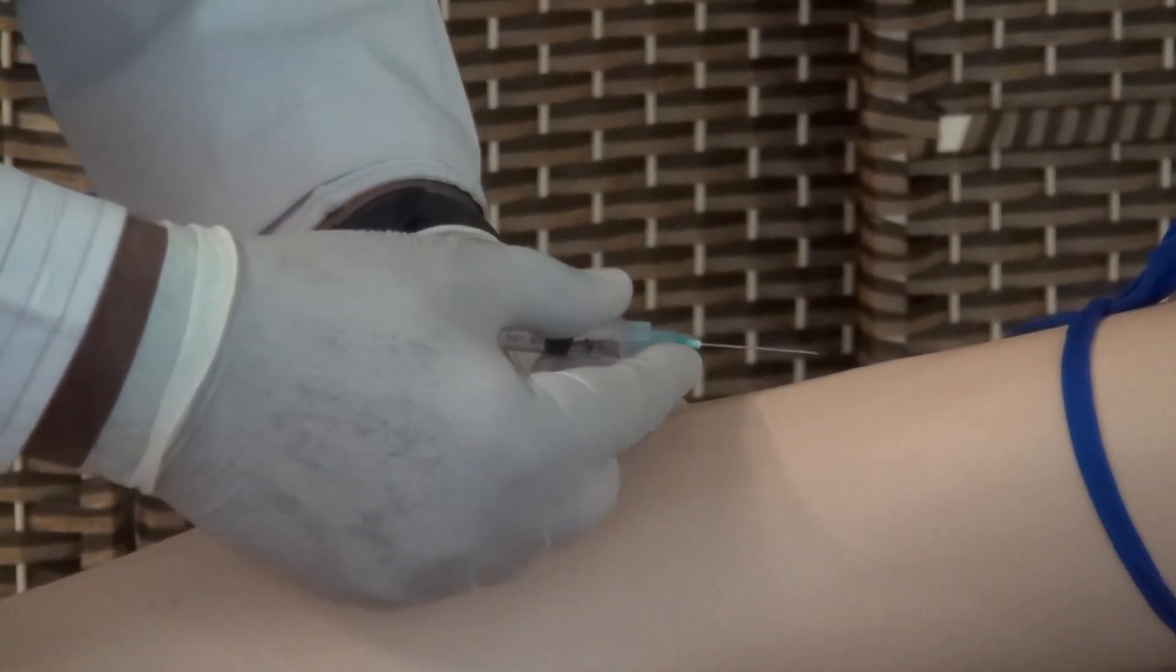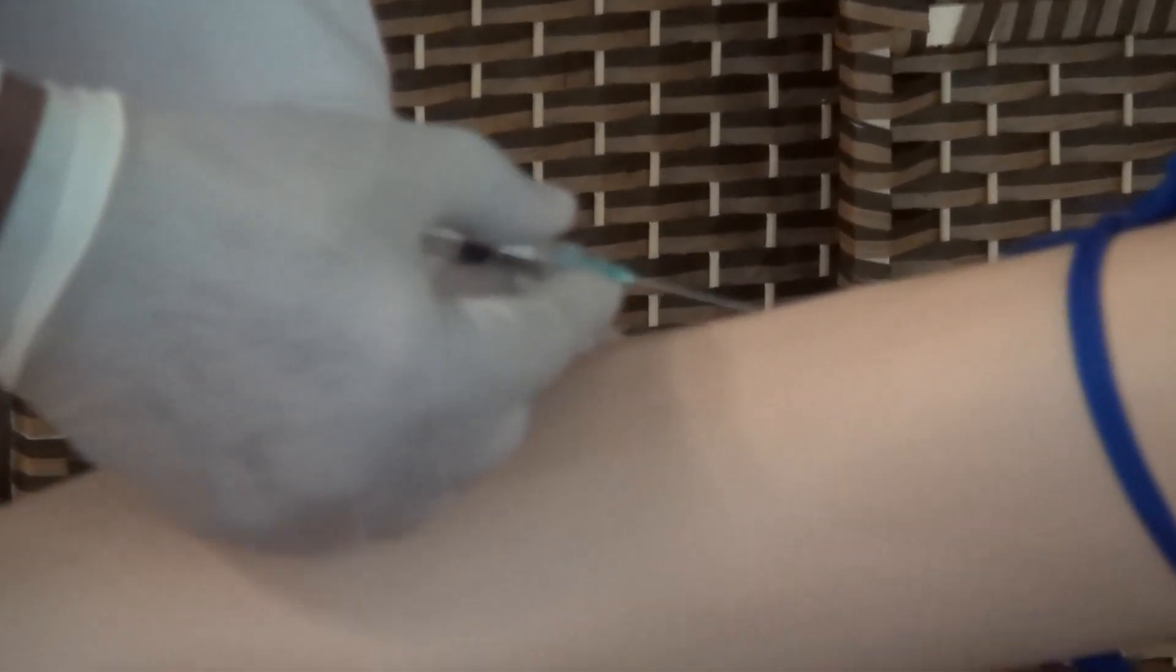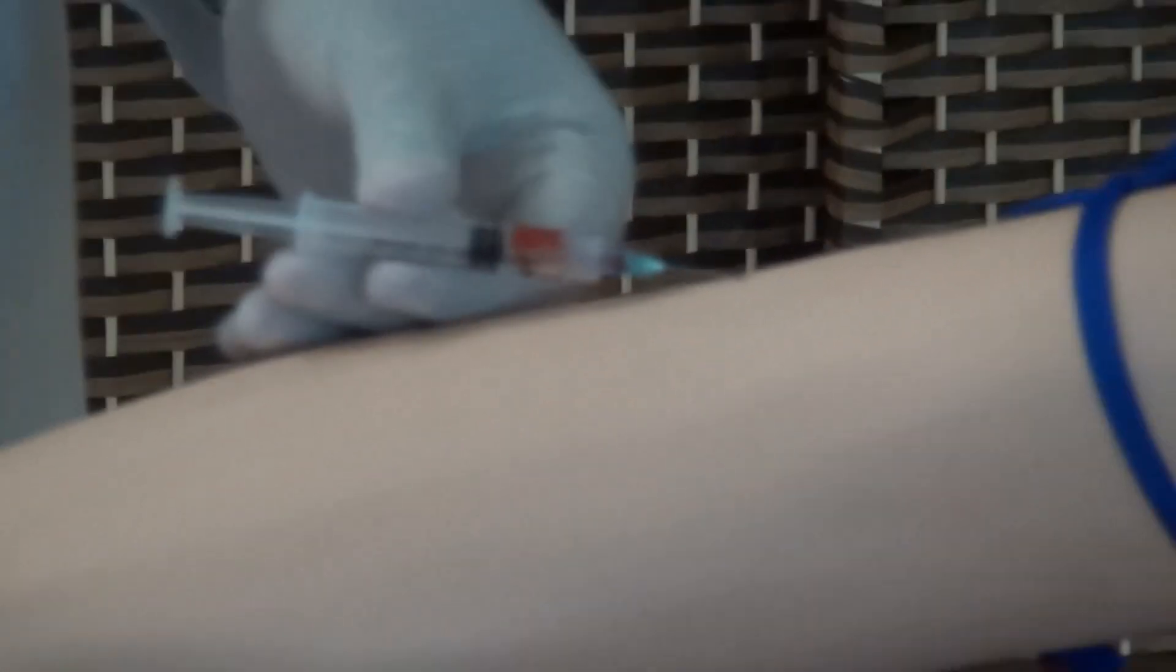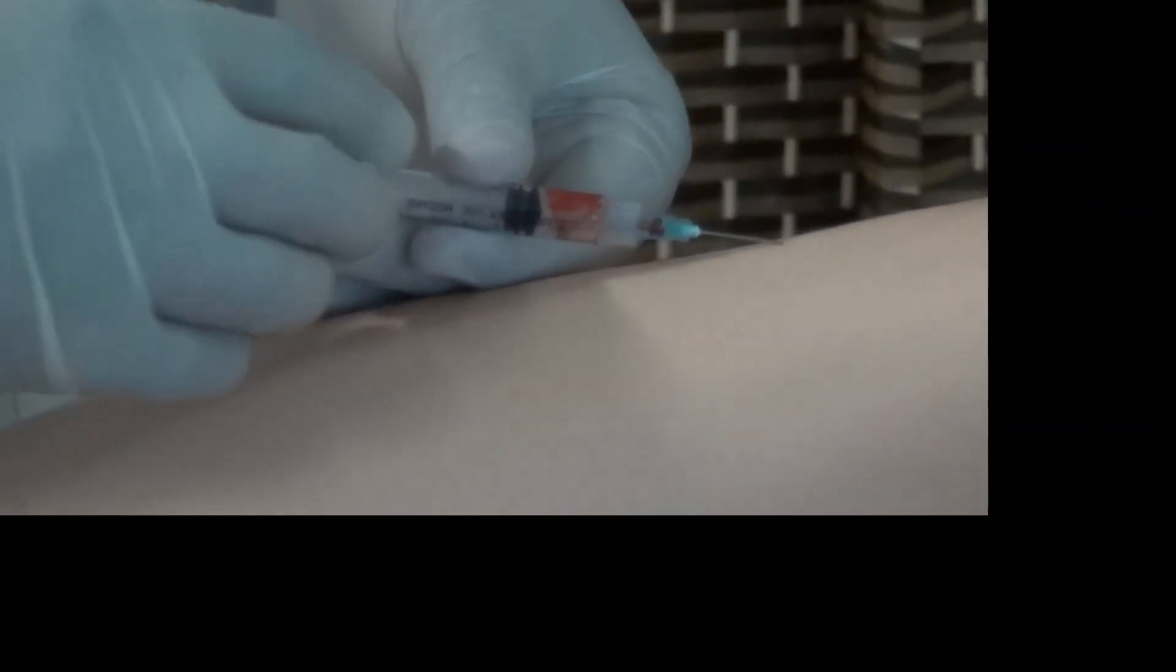Here we go. Along this, you try to fix the vein and then slowly, once you enter, there will be a little give way. Try to draw back some blood so that it's now clear that you are actually within the vessel. Release the tourniquet. And then, once you have ensured that you are within the vein, then just push the drug slowly into the vein.